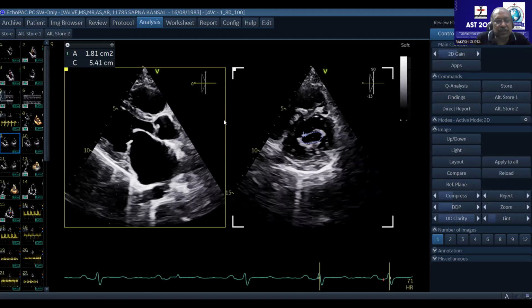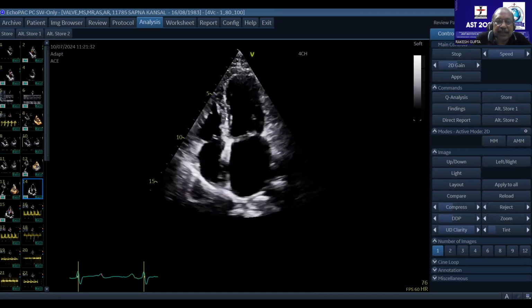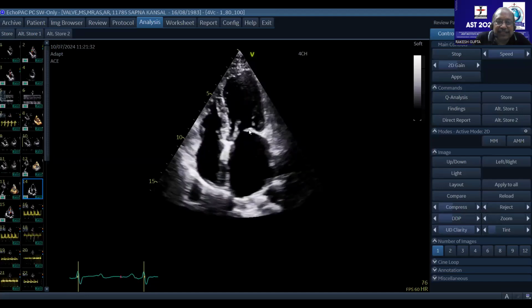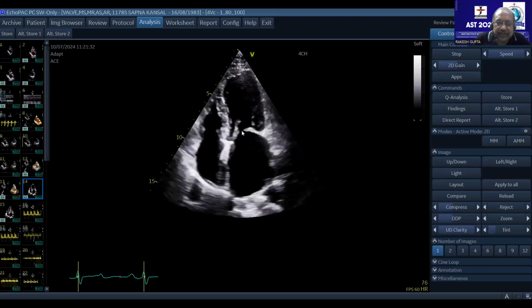Now your question could be a different one. Your question is how to get the best mitral area without this particular facility, correct? If you have to get this without this facility, concentrate on this slide. This is the papillary muscle over here, this is the apex, and this is the mitral valve leaflet. Is that correct?